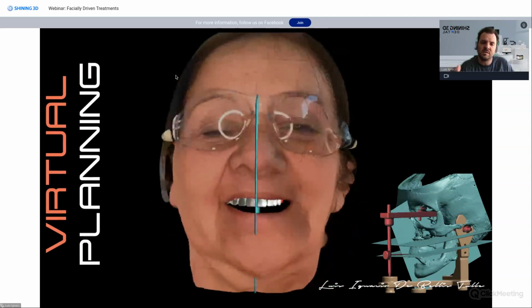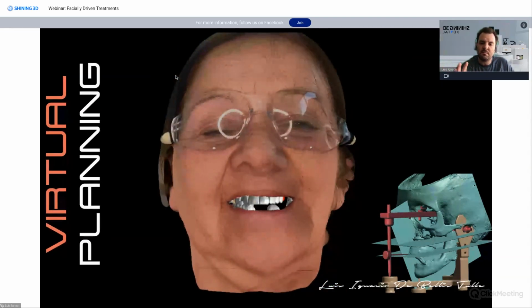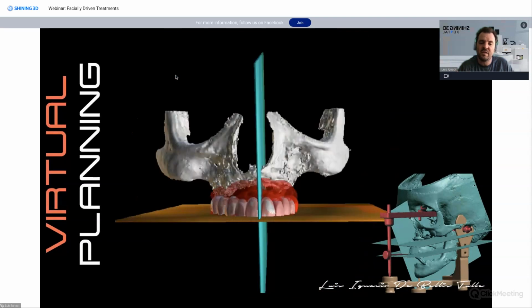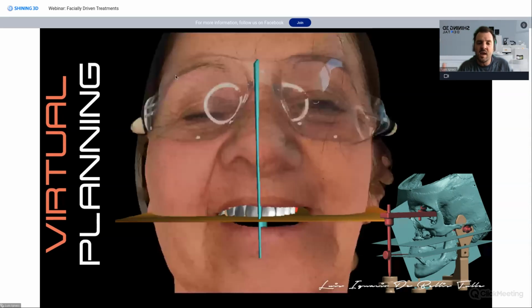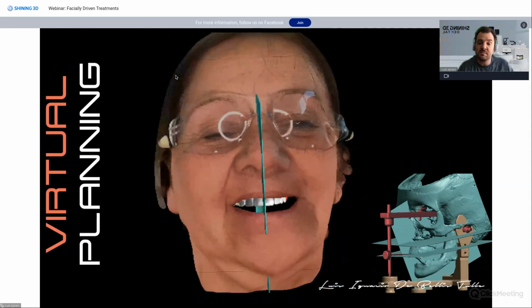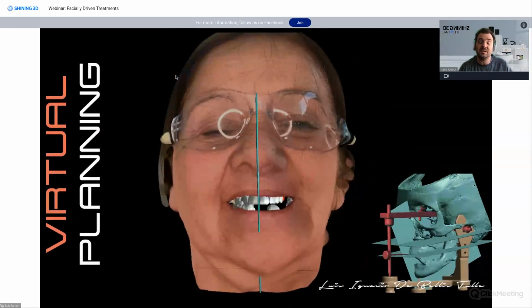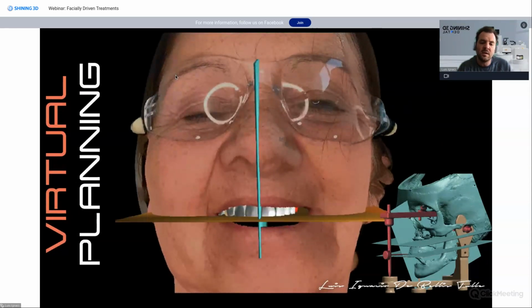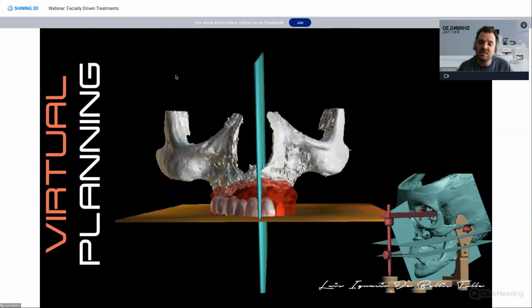To make this look in the nicest way has been a headache, and thanks to facial scanning and all these 3D protocols, I've been able to make it easier, and it has given me the possibility of rectifying problems without having the patient sitting with me in my dental practice.